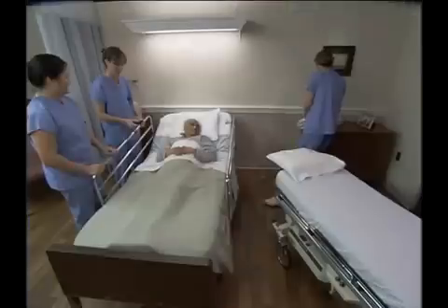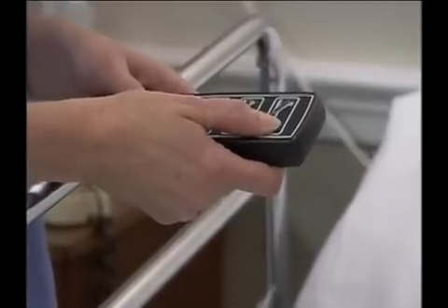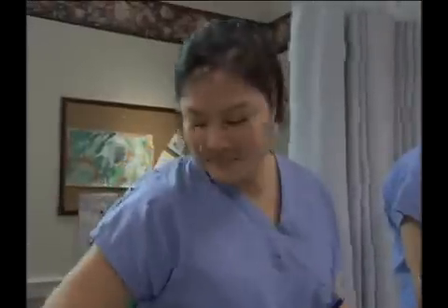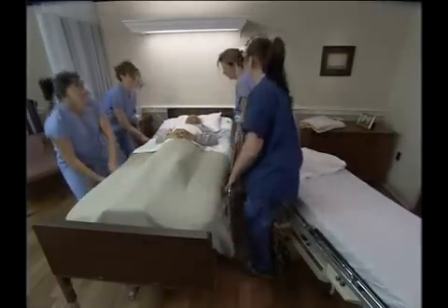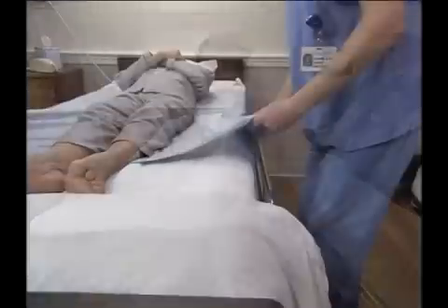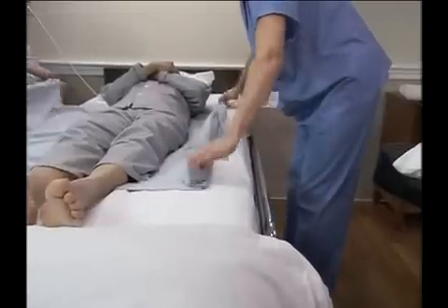After identifying yourself and your co-workers to the person, and after explaining the procedure, raise the bed to its highest level. If there aren't any contraindications, lower the head of the bed so that the bed is flat. Make sure the bed's wheels are locked. Lower both side rails. Then, fan fold the top linens to the bottom of the bed. If necessary, untuck the lift sheet in preparation for transferring the person.